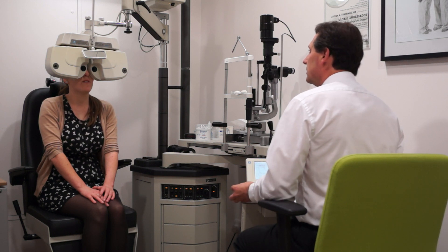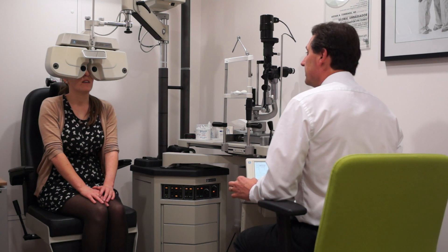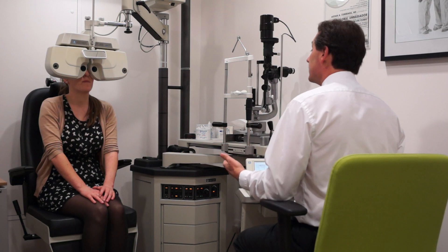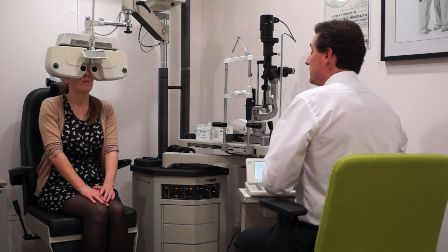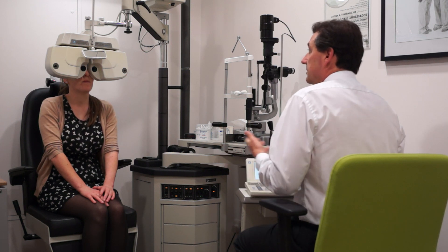Well, I see all four. Great. What color is the dot at the bottom? The dot on the bottom is switching. Between? Green and red. Right. Fantastic. So you are alternately suppressing.